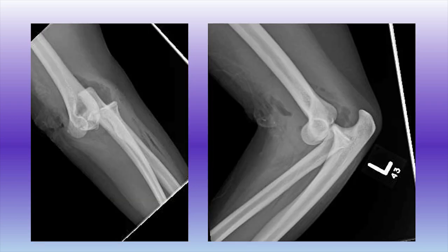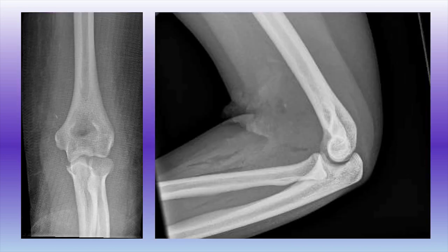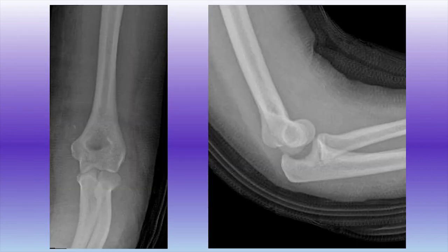This is a 17-year-old patient who fell off of a horse. She suffered an open elbow dislocation with an anterior puncture wound. She was treated by another physician with an irrigation debridement and a closed reduction. Post-reduction x-rays demonstrate a concentric reduction. X-rays one week after the injury demonstrate loss of reduction with posterolateral rotatory instability. At that point, the patient was referred to me and I recommended an open exploration and lateral collateral ligament repair.